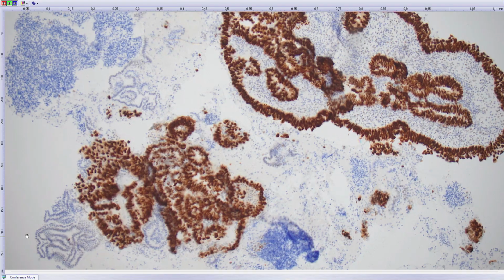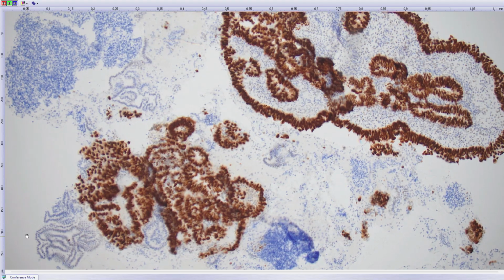You can also have here endometrioid carcinoma, which can also arise in the setting of endometrial polyp, but typically there is hyperplasia transforming into previously called atypical complex hyperplasia or endometrioid intraepithelial neoplasia, and then in this setting you can also see the carcinomatous component, and for serous carcinoma it is more typical to arise in the background of atrophic type of the polyp. And the older the patient, the higher the probability of this atrophic type polyp and this type of carcinoma.